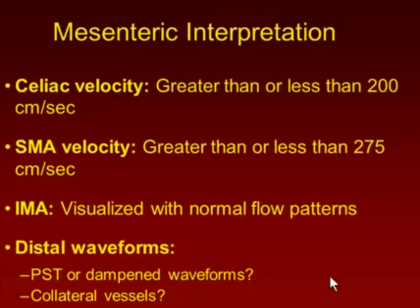Are the distal waveforms dampened? Is there poststenotic turbulence? Is there a lot of collateral vessel development? All of those can be clues to hemodynamically significant stenosis present.